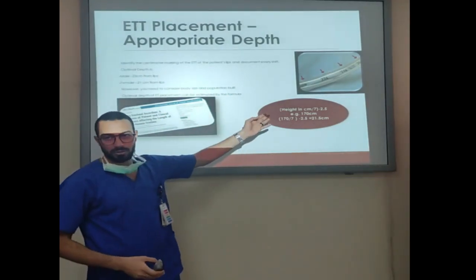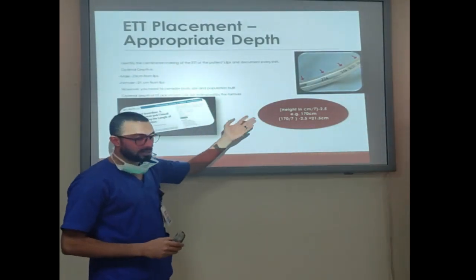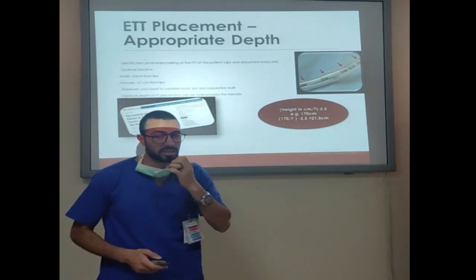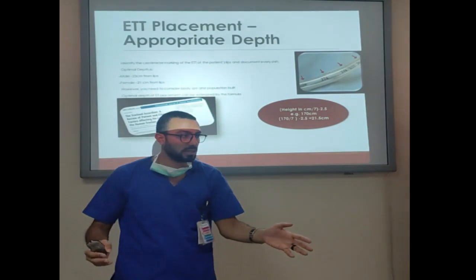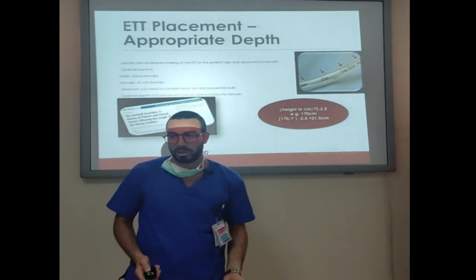So this is a good way to assess the level, the same level every day during endorsement in the handover process. Normally the average is 22. Males should be like 23, females 21, but let's say the average is 22 on the lips.